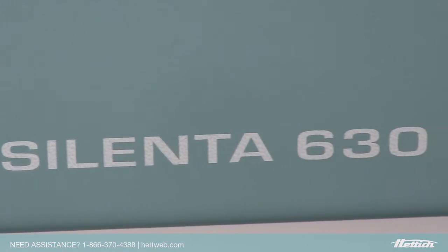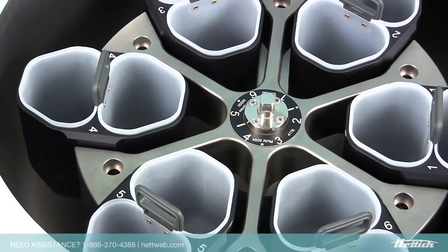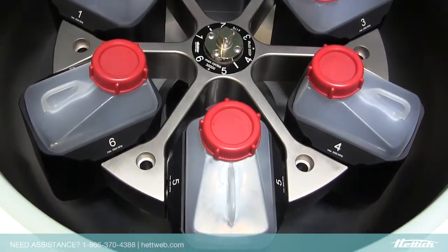The Silenta is the market leader in 12-liter centrifuges, with the ability to process up to 12 blood bags in a single run, ranging from 250 to 500 ml, and bottles up to 2 liters in capacity.